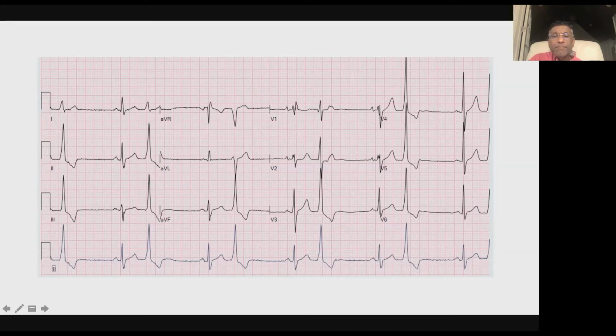It looks atypical, sir. Good. It is atypical. So atypical would make it ventricular. If it was a typical left bundle, then it would be just supraventricular conducting with left bundle branch block. Does that make sense? So it's basically a normal P wave. Let's say a PAC. If a premature atrial beat, APC or PAC, was here, and then it conducted down and it encountered left bundle block, then you'd get a typical left bundle here.